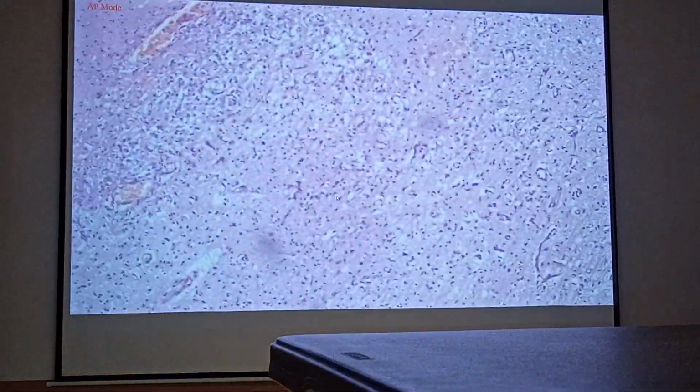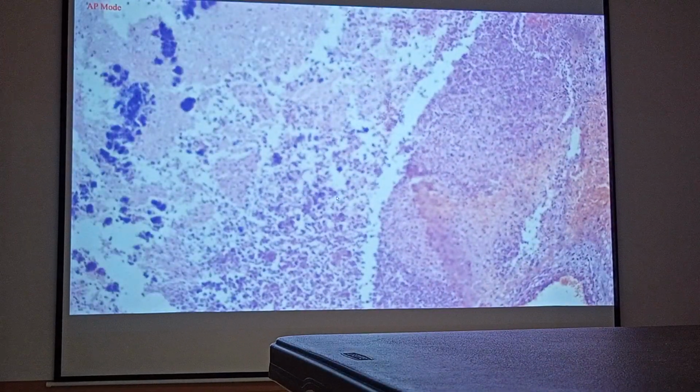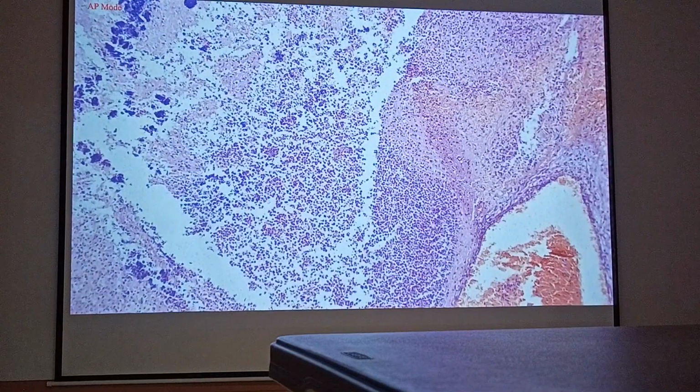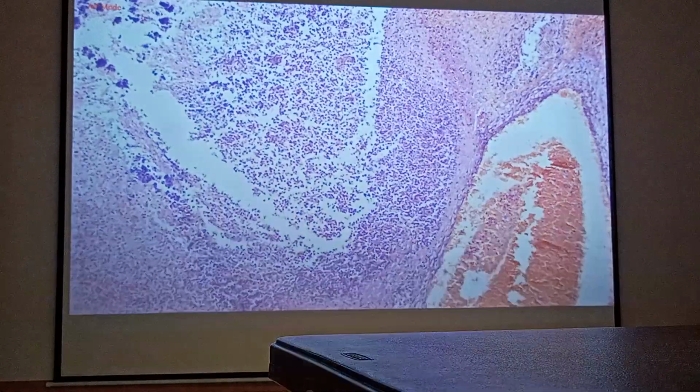And then, in this portion of the brain, an abscess has developed. A marked degree of cellularity will be seen in this area because there is a localized collection of pus. What type of necrosis is present? Liquefactive.